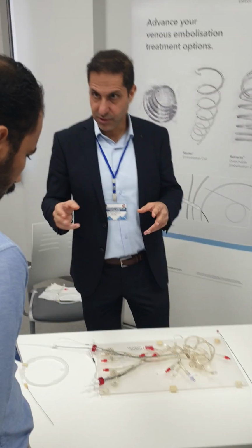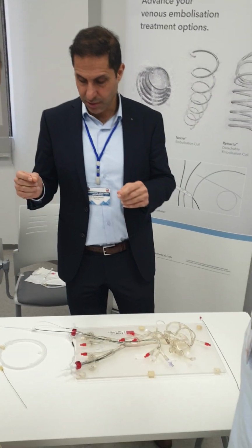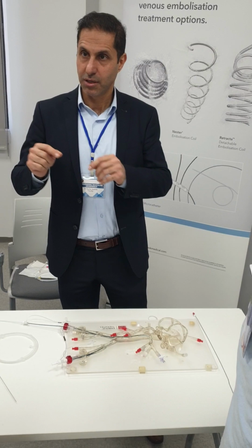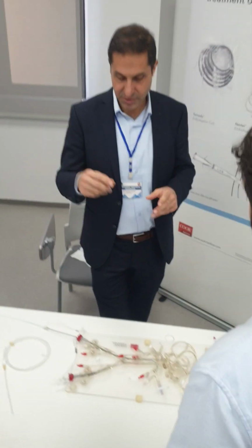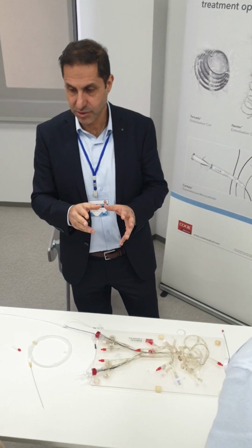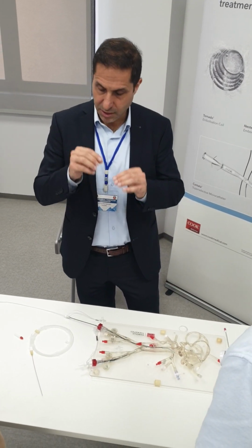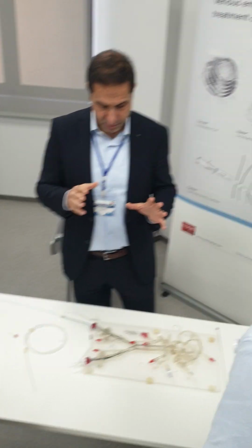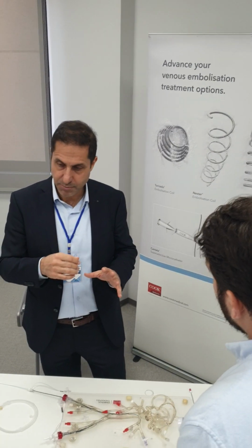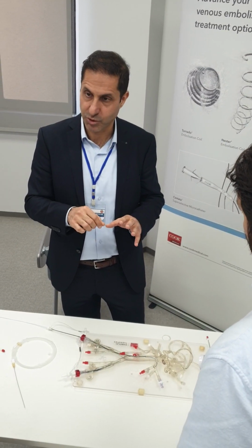We are talking about different types of coils: pushable, retractable, or retrievable coils. Pushable coils, once you push them inside a vessel or a target region, once they are inside the catheter, they are not to be retrieved. So you deploy them, you have to be certain about the position.